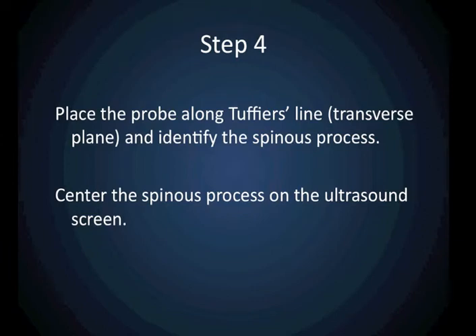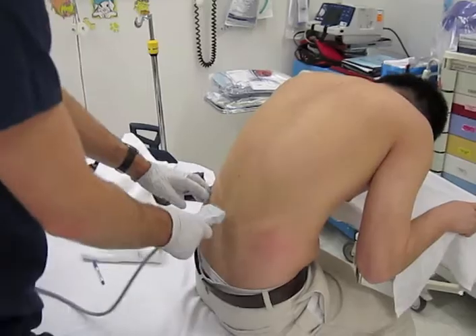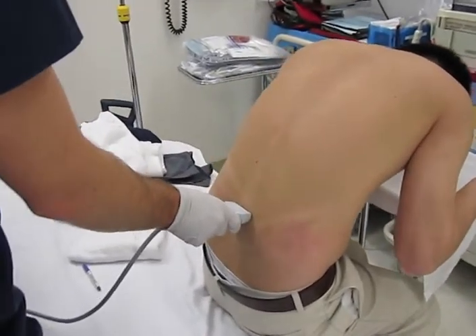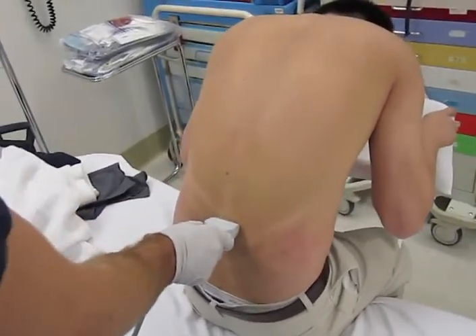Next, you are going to place the ultrasound probe along Tufier's line in a transverse plane. In this orientation, you are going to keep the ultrasound probe marker to your left and to the patient's left.